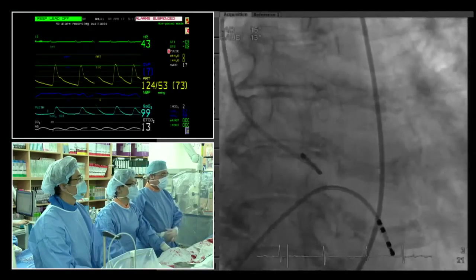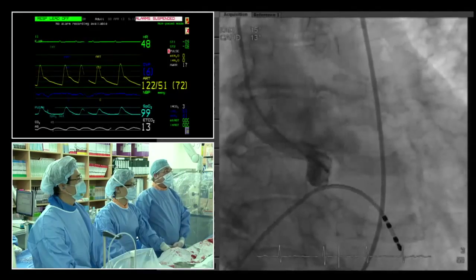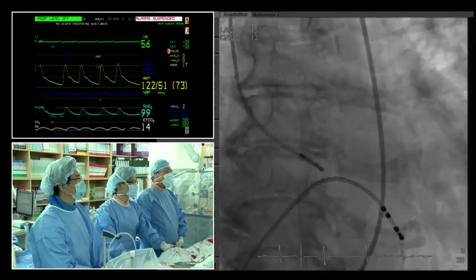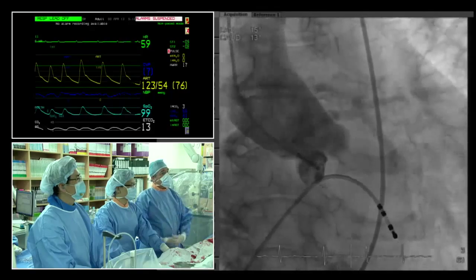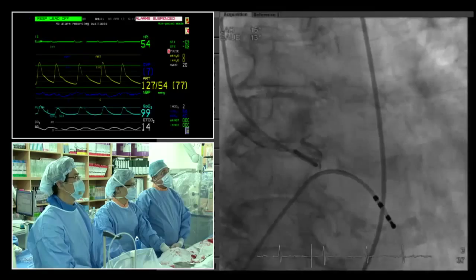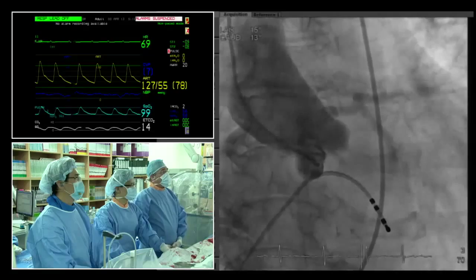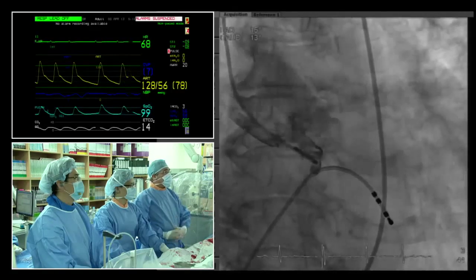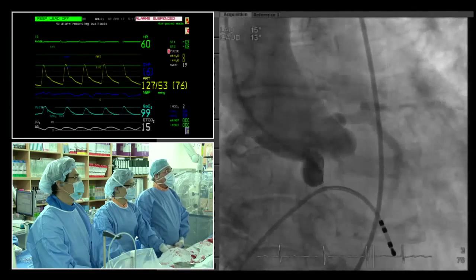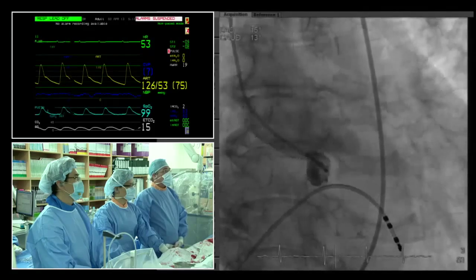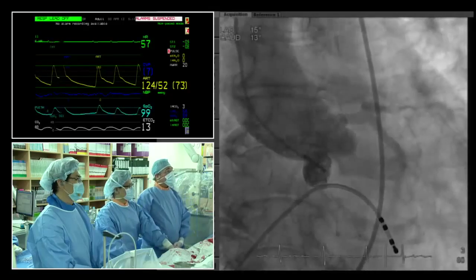The last issue we discussed is coronary risk. We need to assess safety regarding the left main and right coronary ostium, especially since we lack the measurement at the sinotubular junction where both ostia are close together. We will assess coronary patency by angiogram at the time of implantation — we feel there is not too much risk here, but it must be confirmed.